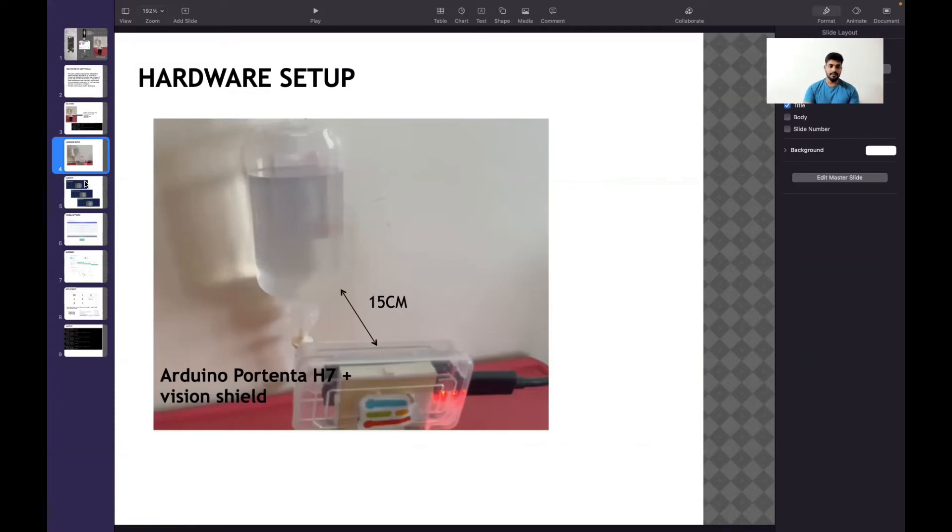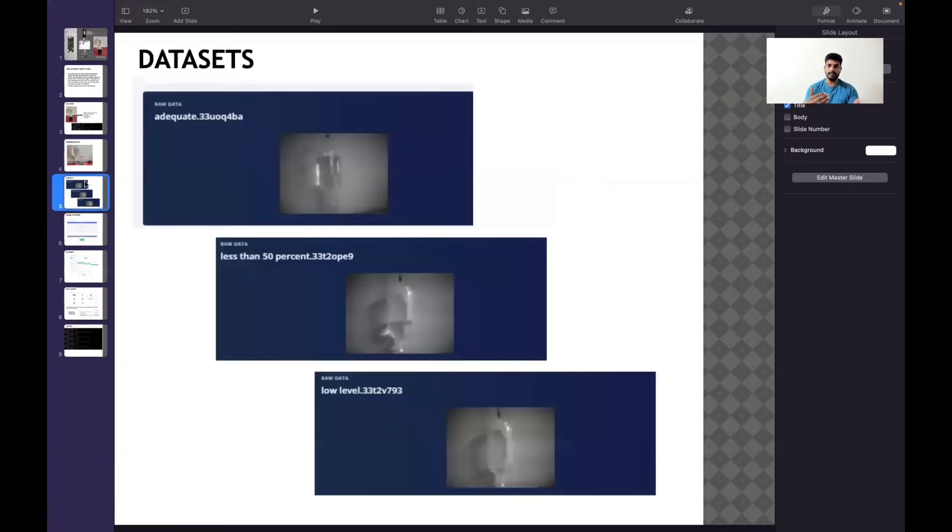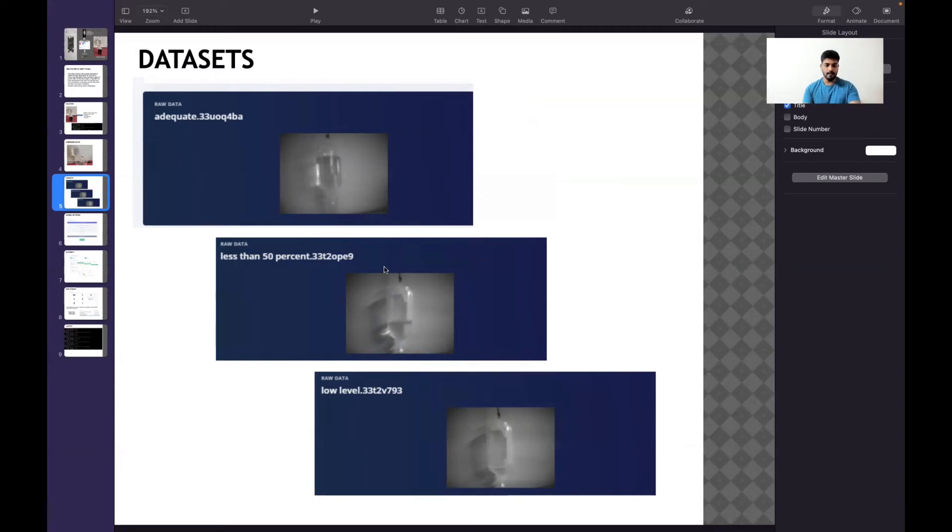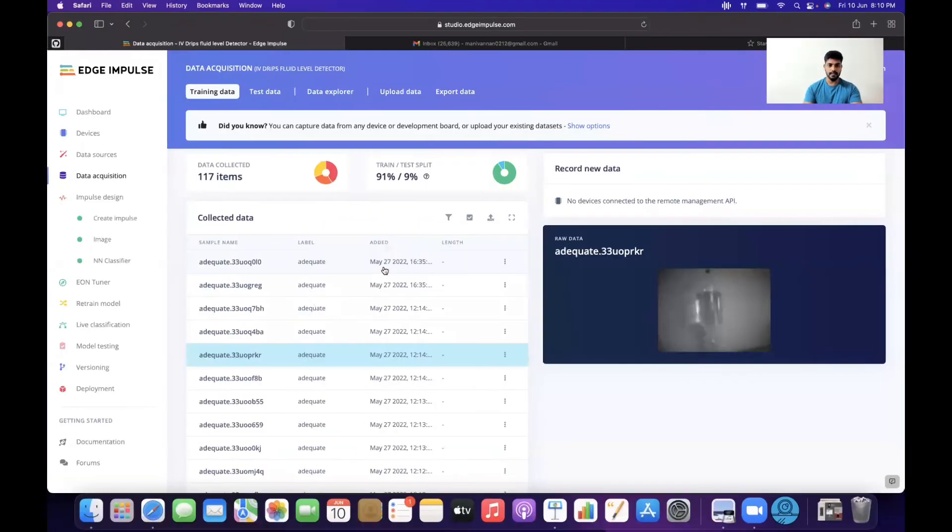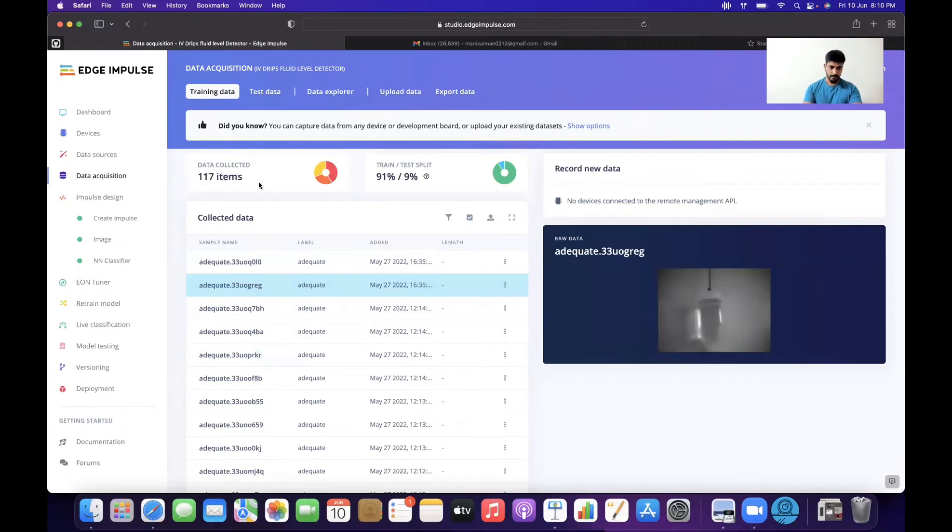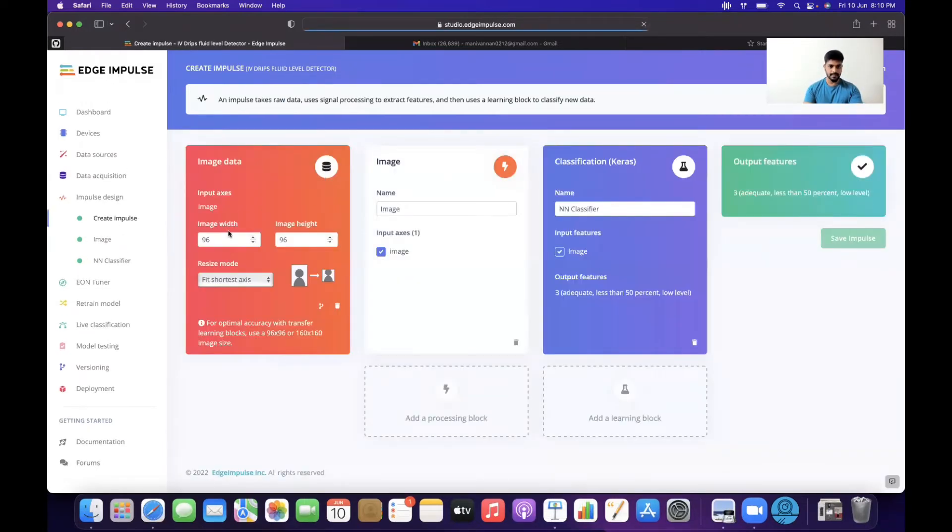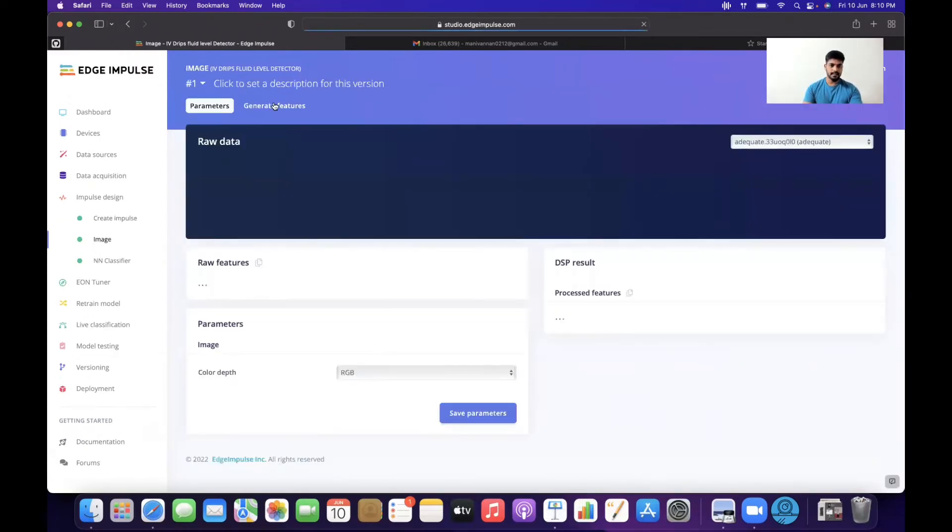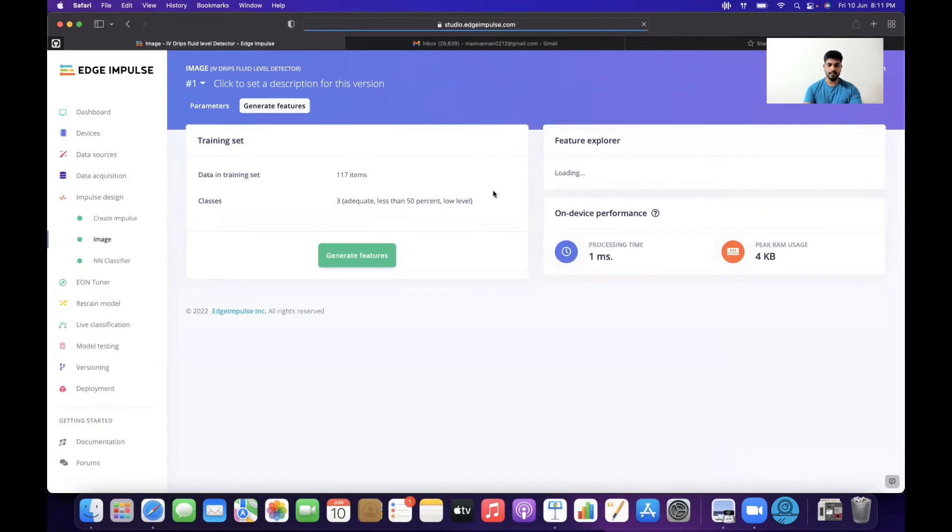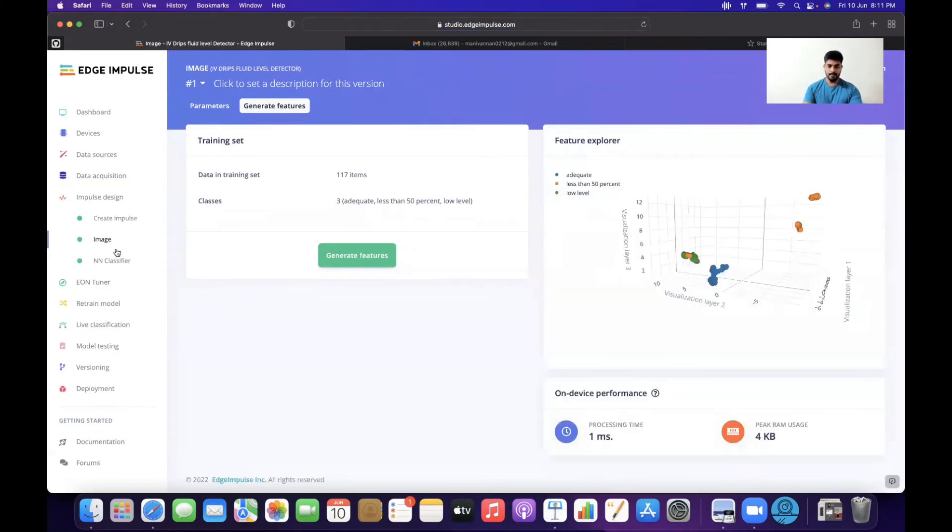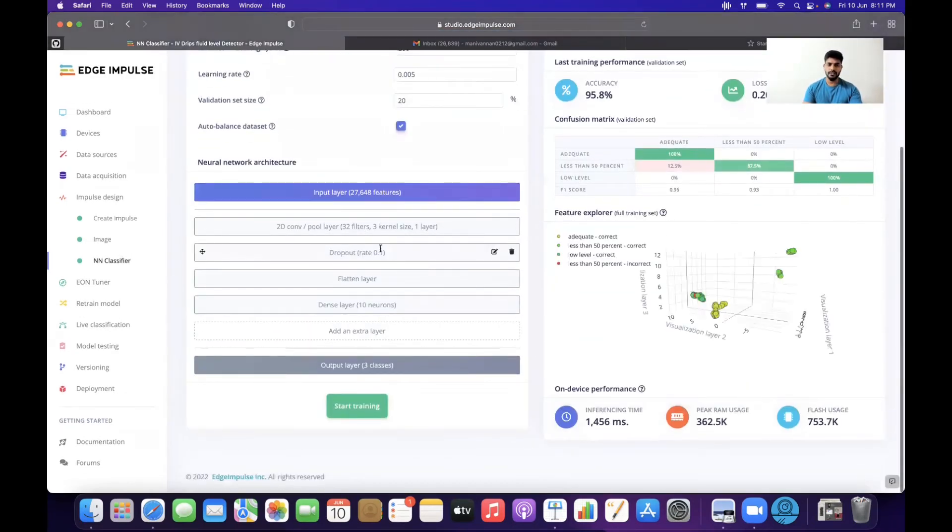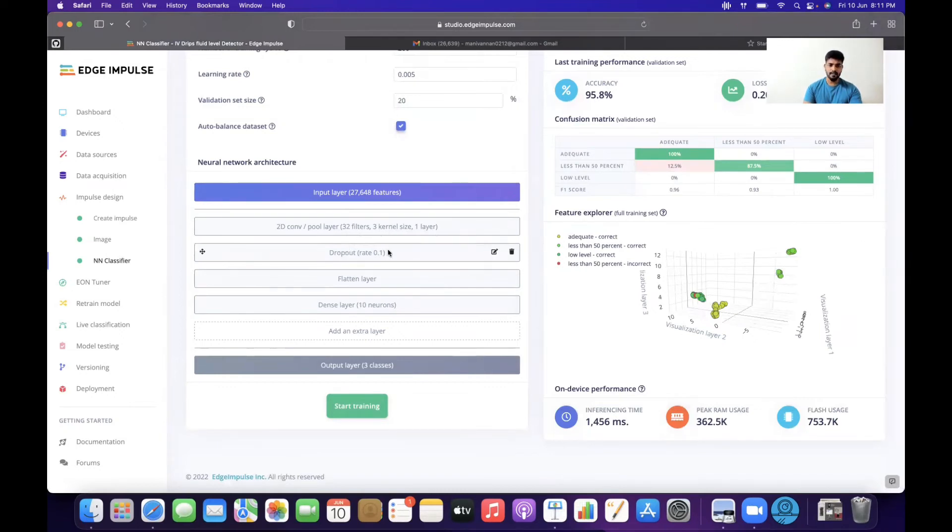Here's a brief overview of the datasets I collected: adequate, less than 50 percent (almost at 50%), and low level (almost completely drained with very little fluid). I used an impulse model where I collected datasets of 176 images. The input image dimensions are 96x96, using neural network classification. I generated the features in the neural network classifier.